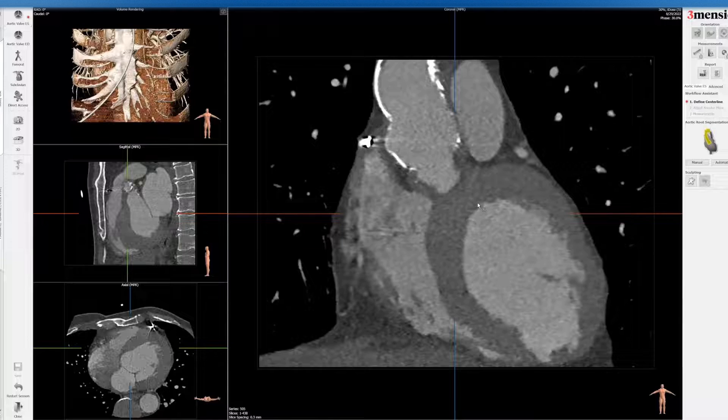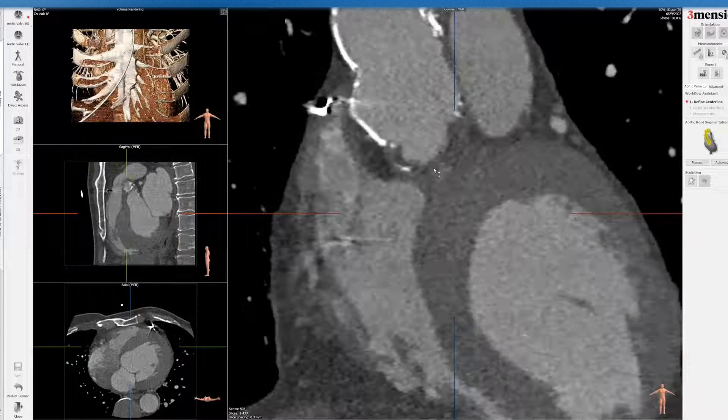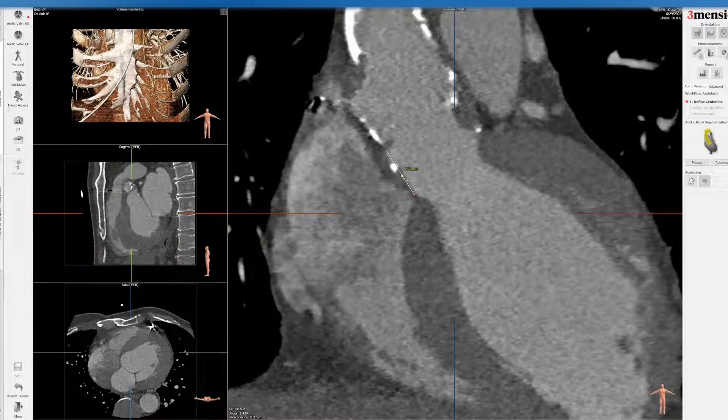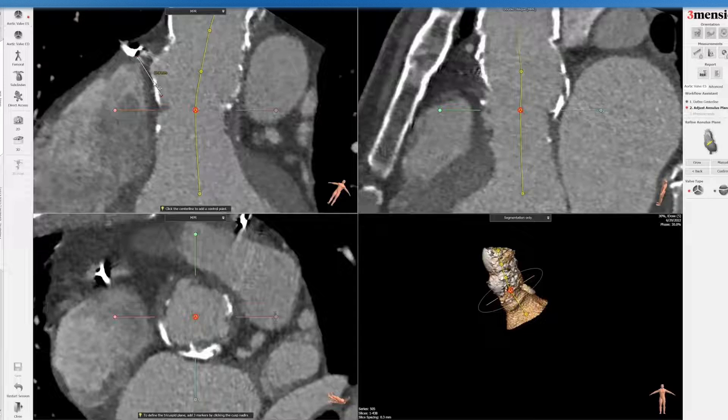First I'm going to double-click here to look at the septal length, because this is an anatomy that would be in continuity with the LVOT. You can see here — this is an estimate of what that might entail. We're going to save that image before going ahead with the automated segmentation. Depending on which valve you use, it might interrupt the LVOT, because it's not a standard surgical valve and the native anatomy still exists, so there might be risk of interacting with it.